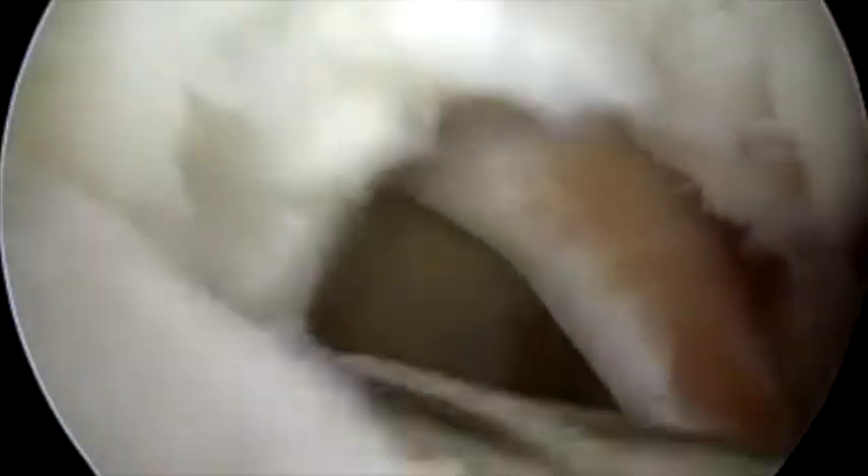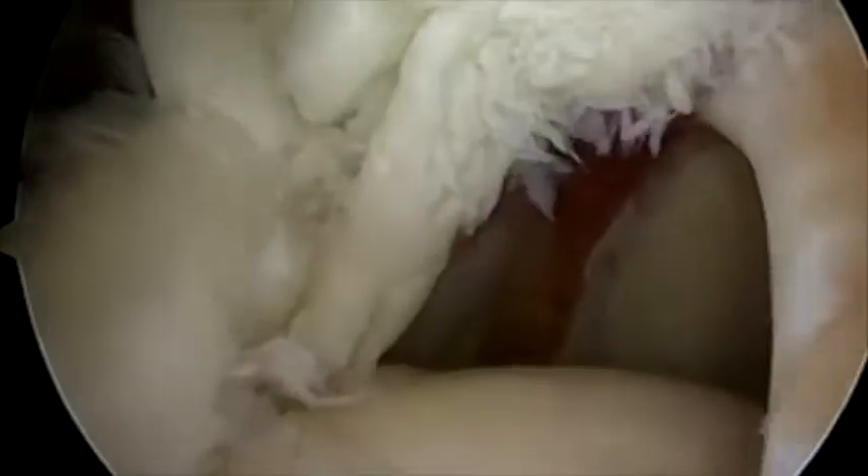A motorized shaver is placed through the accessory anterolateral portal and bursa are removed. Tissue manipulators are utilized to identify the location of the tear as well as the tear morphology. The arthroscope is then switched to the anterolateral portal in order to better visualize the tear.